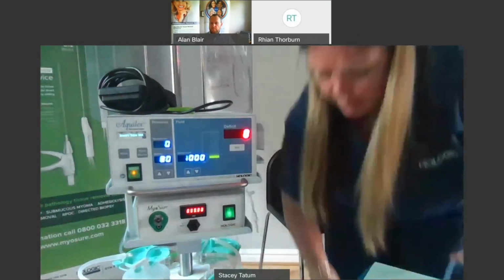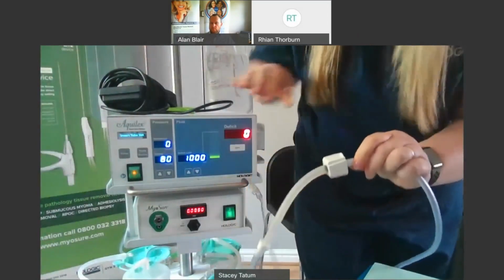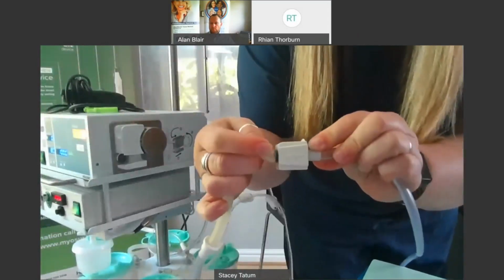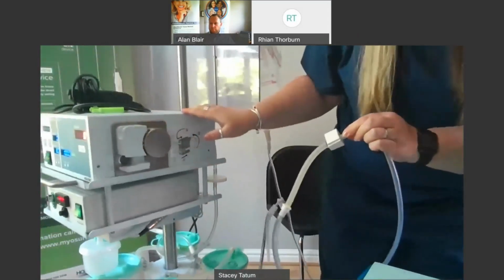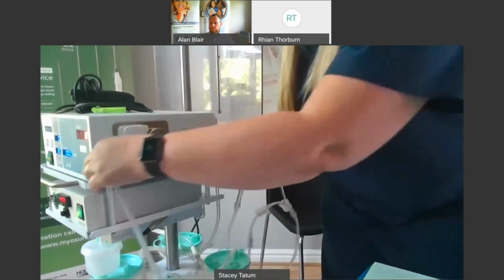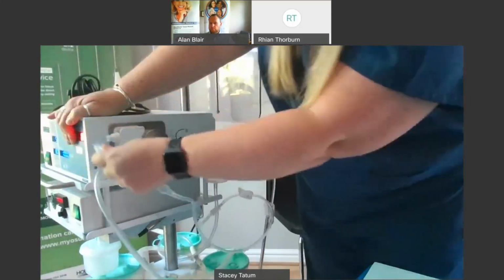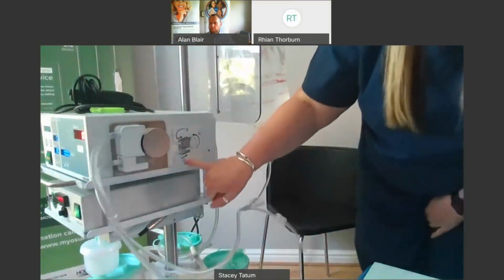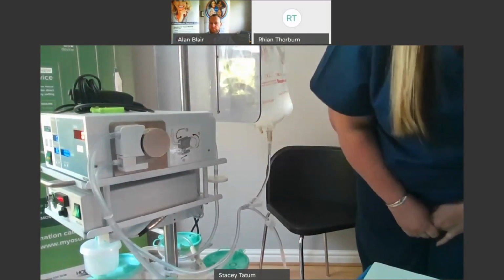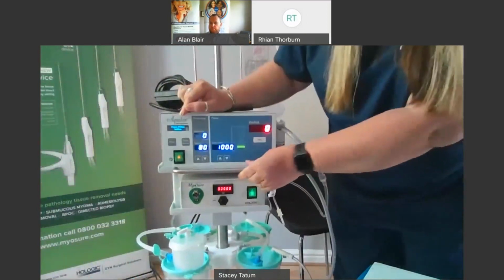I'm then going to put the microchip into the machine. On each microchip there is an arrow, and there's also an arrow on the housing that it goes into. So you line up the arrows in the same direction, slide it into the housing, and give it a good tug around. There is a 1, 2, 3 diagram on the side to help you as well. And once that's done, the machine will ask you to prime the system.